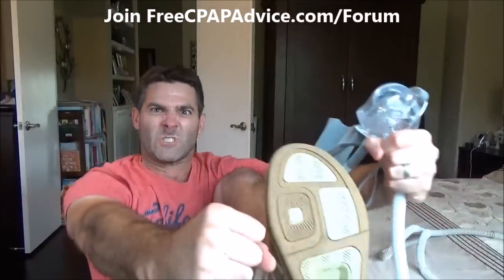But if I don't do that, if I do this and pull it up to keep it from digging into my ear, it pulls down on my scalp and my skull. And I can't sleep because it feels like someone's got a belt over my head, and it hurts. So I have to suck it up and let it cut into my ear like I have a bandsaw going on my ear all night. And that kind of hurts too. So that's another reason why I'm a little iffy on this mask.